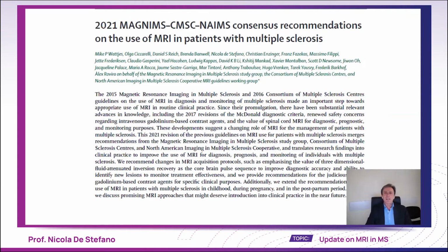In this respect, as you know, there have been lots of different guidelines on how to use MRI in MS. Recently, three different groups of experts in using MRI in MS came together to give, for the first time, a consensus recommendation on how to use MRI in patients with multiple sclerosis.